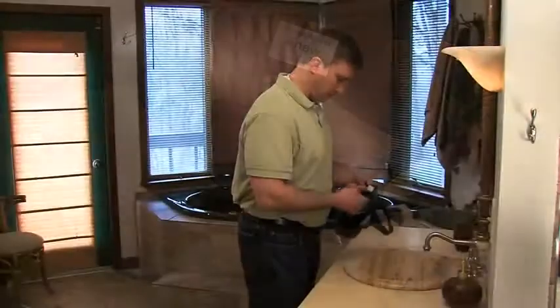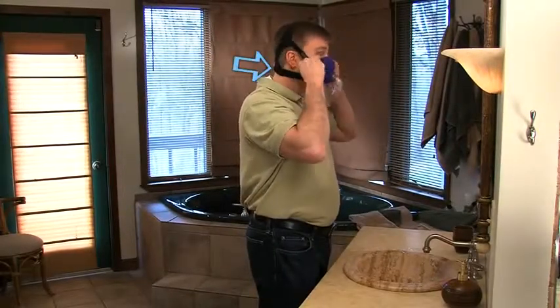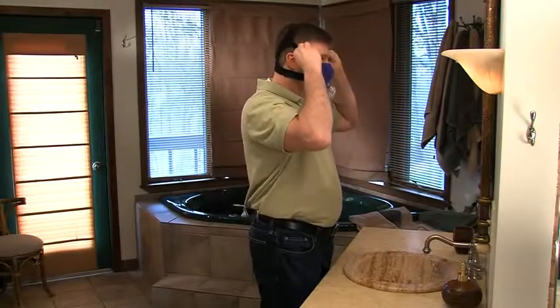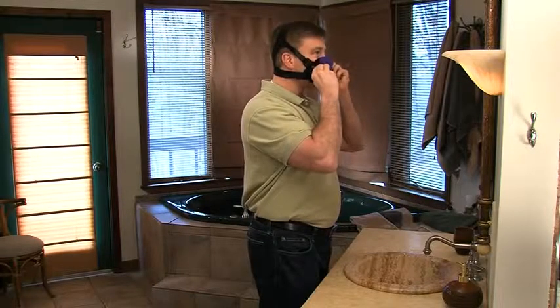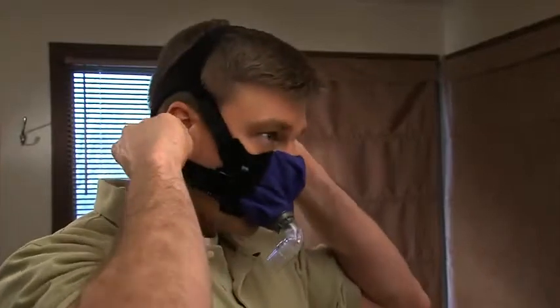Pull the headgear over your head so that the neck support of the headgear rests comfortably on your neck. Important: do not over-tighten the straps. Start with the straps loose and then tighten as necessary to achieve an airtight seal. Adjust the top straps first so that the nasal interface of the mask is comfortably resting on your upper lip.